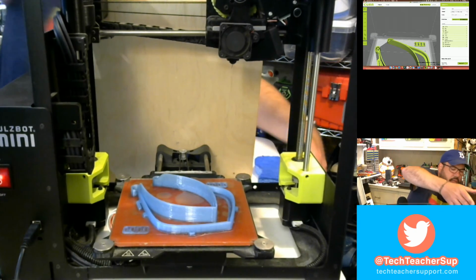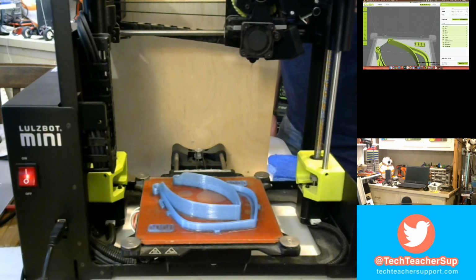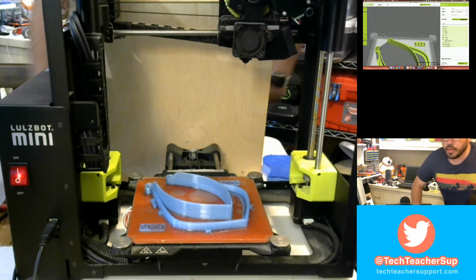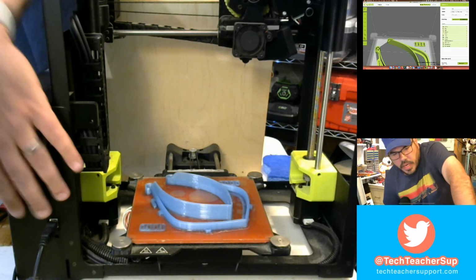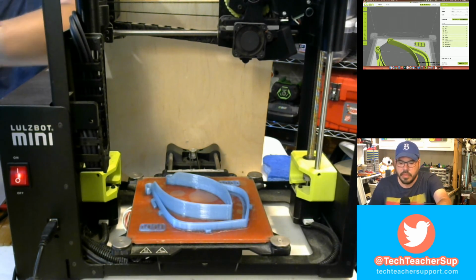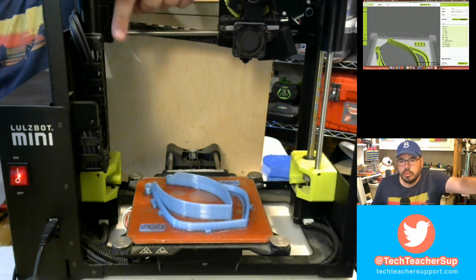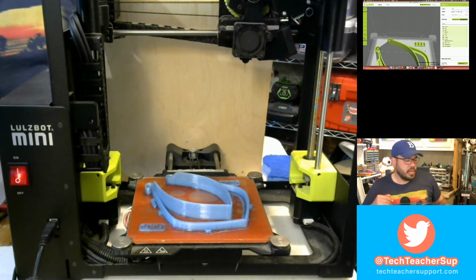All right. And you know what? We might be able to just move this down just a touch there for you. There we go. So we've turned it on. You see right here is a cable. This is the USB cable, so that is going into my laptop. These two are talking to each other now. And now what we need to do is remove this piece so we can print a new one.